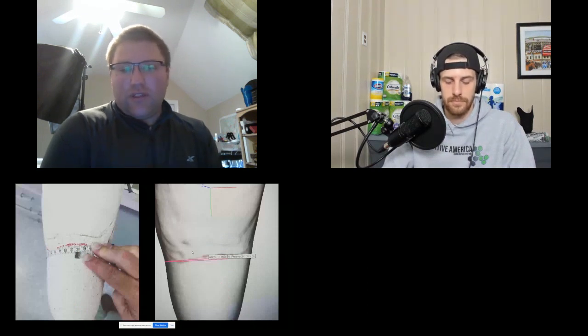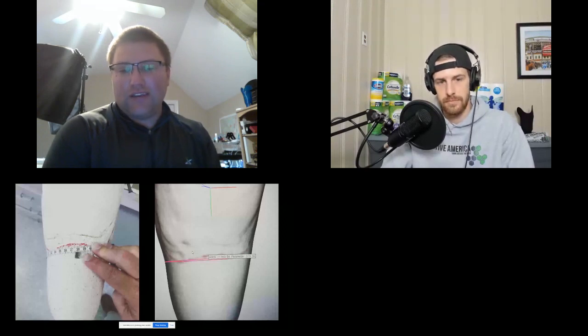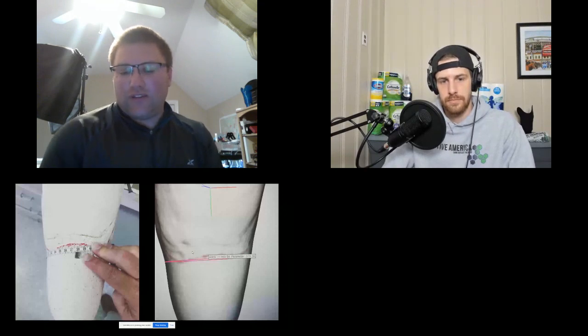So the mold on the left is 375 millimeters, and then when we scanned it and took it digitally, we've got 375.36 millimeters. And to me, that's pretty good. Now, I wanted to share with you guys some before and after videos of some patients here.